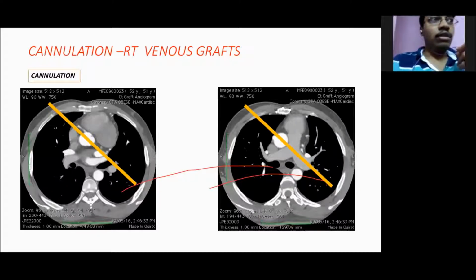Totally no idea where it was. Even an aortic root angiogram was done. The left subclavian could not be visualized. Finally, we went through the left arm. Through the left arm, it was found that the subclavian was totally occluded. So it was an exception, a rare one.